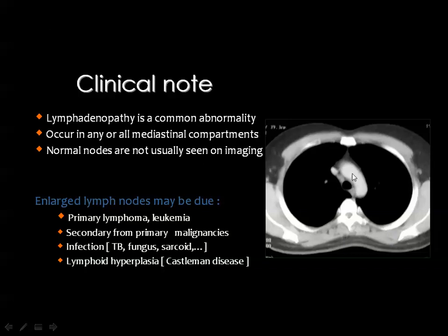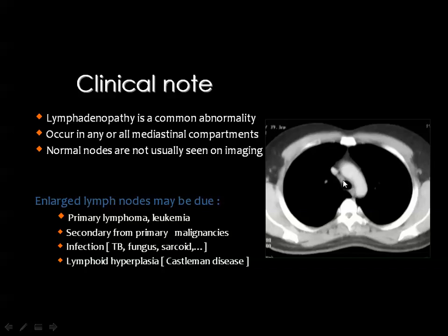A slightly enlarged lymph node posterior to the superior vena cava — the retrocaval lymph node — should not be considered pathological unless there is clinical evidence of disease. If the patient has a known primary malignancy, lymphoma, or sarcoidosis, consider it. But if this is a routine chest CT or checkup examination with no complaints, it can be ignored, as this is the only lymph node allowed to appear this way and still be considered within normal limits.